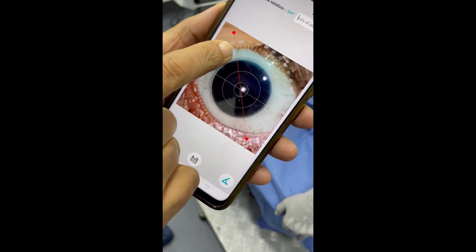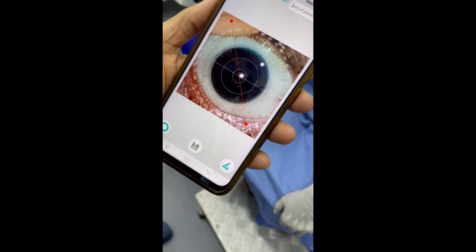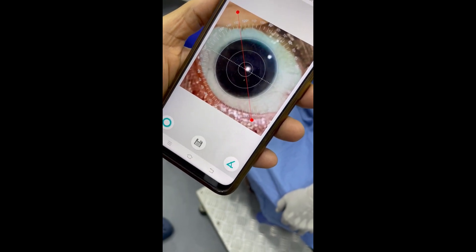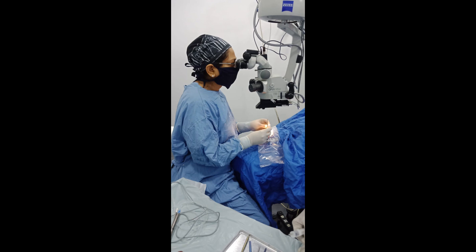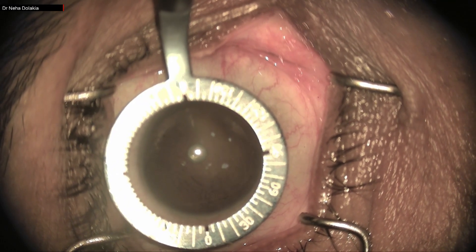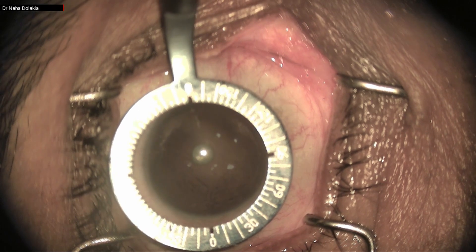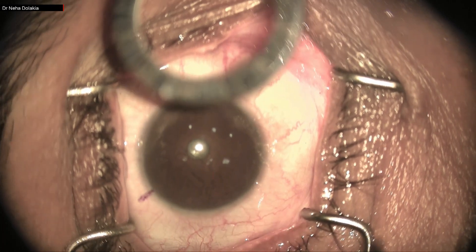So we have two reference marks: 27 degrees in the infero-temporal quadrant and 127 degrees in the supero-temporal quadrant. Now we go on to the marking. I have marked the axes on the table itself — this is a small innovation. The patient is lying supine; I am sitting temporally. We can see the medial canthus; on the left side is the upper lid and on the right side is the lower lid.